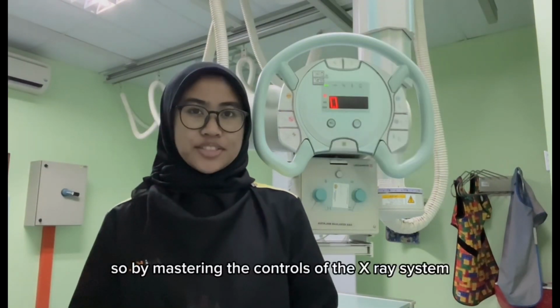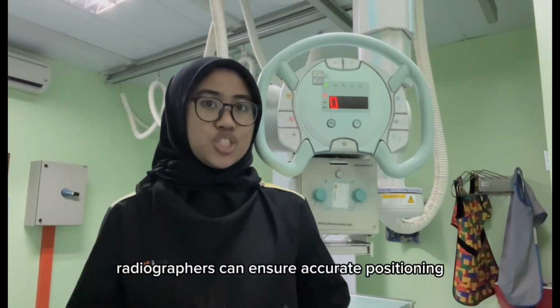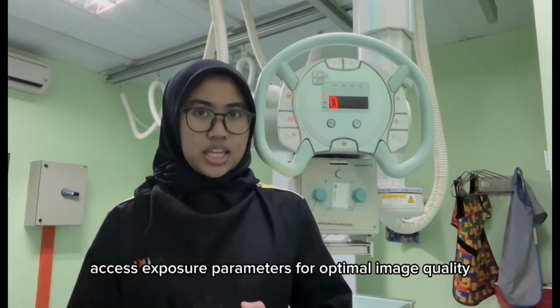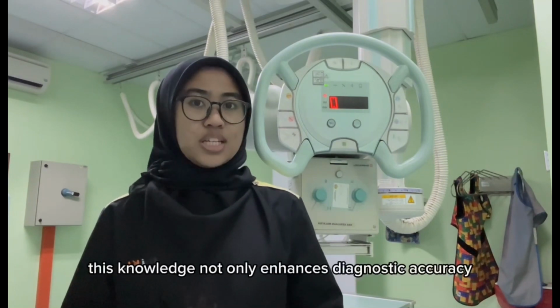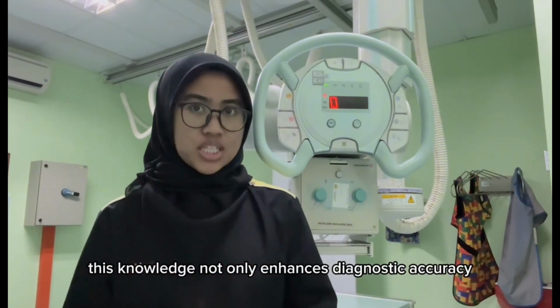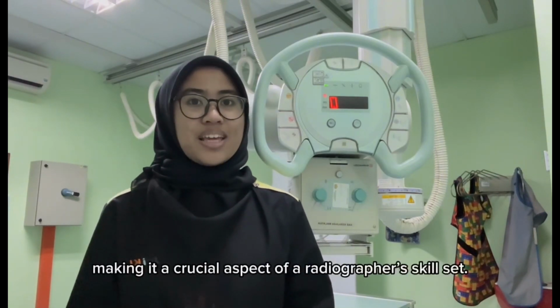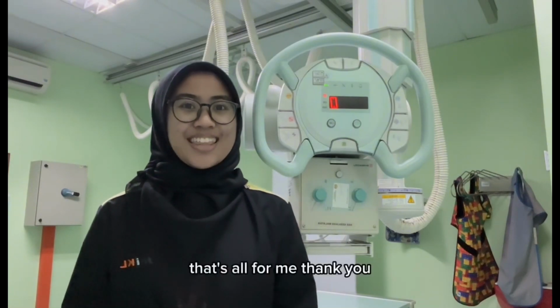By mastering the controls of the X-ray system, radiographers can ensure accurate positioning, adjust exposure parameters for optimal image quality, and minimize unnecessary radiation exposure to patients. This knowledge not only enhances diagnostic accuracy, but also prioritizes patient safety, making it a crucial aspect of a radiographer's skill set. That's all from me.